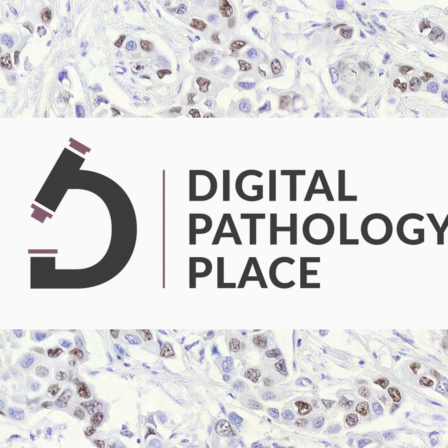Interesting. So what they did, they took 25 blood smears, and each of those blood smears was from a different patient. Then they were manually prepared, stained, and sorted into 4 groups, and each group underwent imaging using different cameras integrated into a light microscope with 40x microscopic lenses. So they did it with a microscopic camera. They didn't do this with scanning.